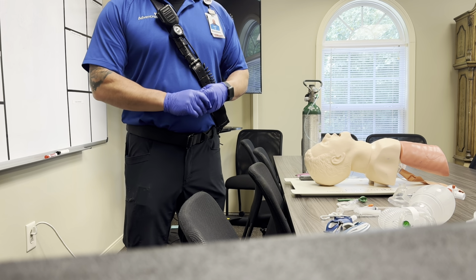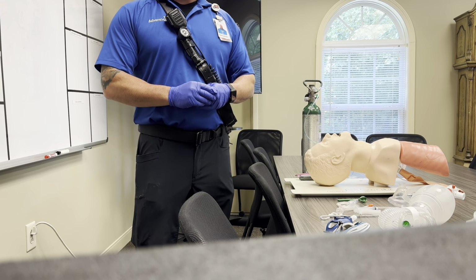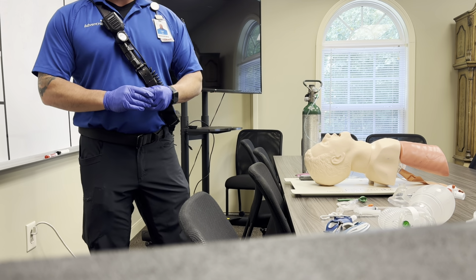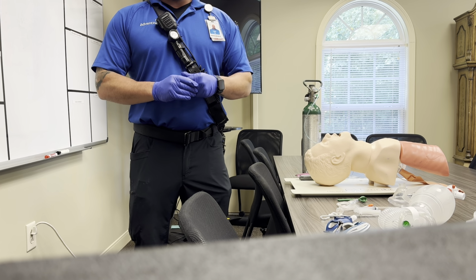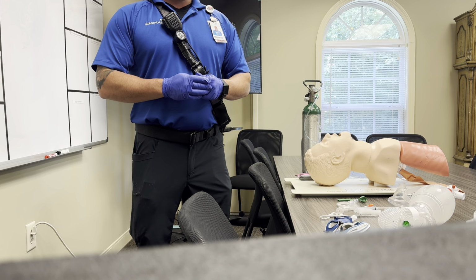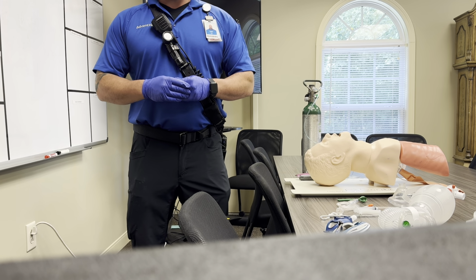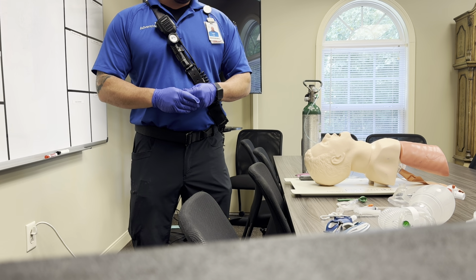So you as a student should be able to tell me some indications and contraindications. Just a few indications, obviously, patients in cardiac arrest, they can't control their airway, etc. Contraindications, that patient has an intact gag reflex. Let's say you're a service that doesn't carry any paralytics, anything like that, that they can RSI a patient. That would be a contraindication.